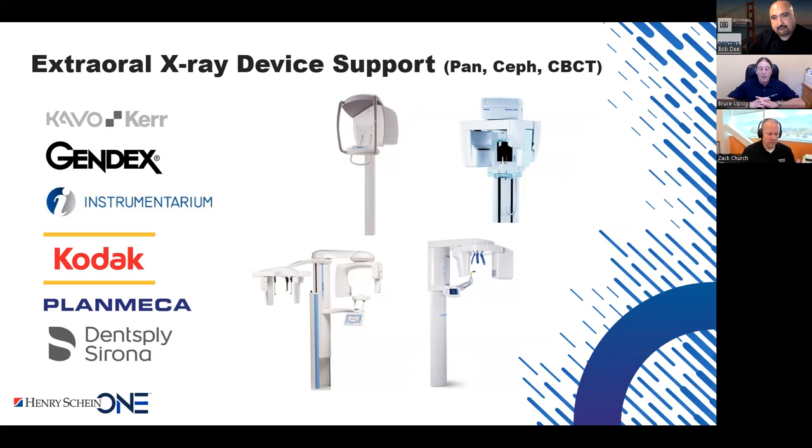Well, we're a little bit at the mercy of the hardware sometimes. We integrate as deeply as we can to as many hardware devices as we can. Some hardware devices offer us deeper capabilities than others, so we're a little bit at the mercy of them sometimes. But it is true that making them work properly in the workflow of the practice is the key, and that's what we always strive to work backwards from. And now, Zach, if you could move forward one more slide.